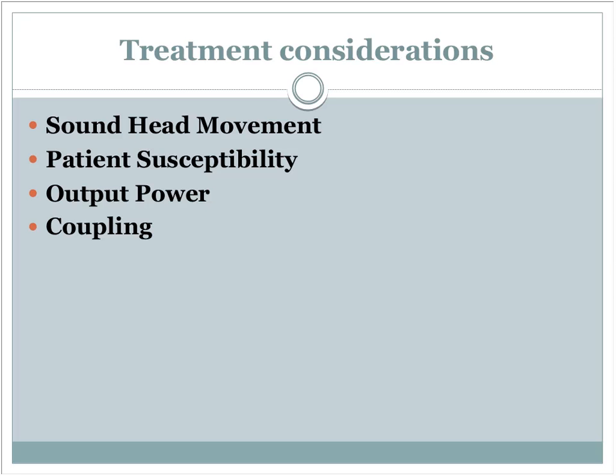Along those lines, you have 2 settings usually, a 1 megahertz and a 3 megahertz. And where that comes into play is how deep is the structure you're trying to influence, I suppose is the best way to say that. Thinking back to the waves again, like we talked about in E-stim, you have the horizontal line, and you have this wave that undulates above and below, that nice sinusoidal waveform.